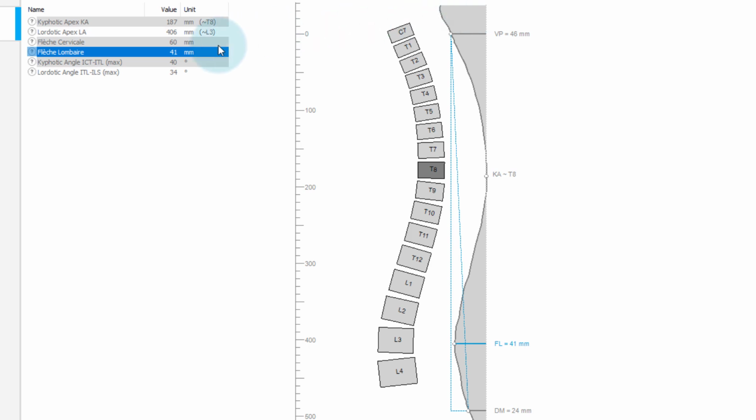For this reason, and for the reason of a simpler basis, it is easiest to use an alternative point. This is displayed in the middle graphic and measures the distance from VP to the wall instead. This solves two problems at once. First, VP is always measurable. Second, the clinical comparison between flèche cervicale and flèche lombaire is much easier to make.